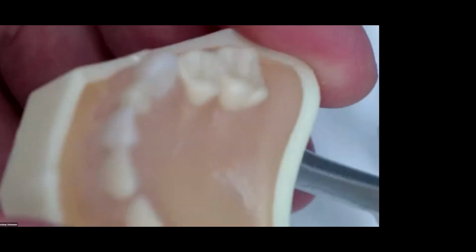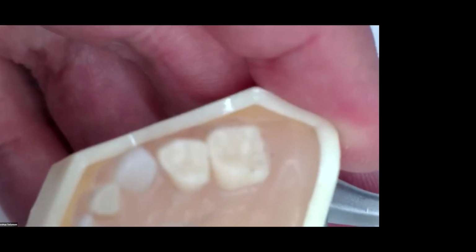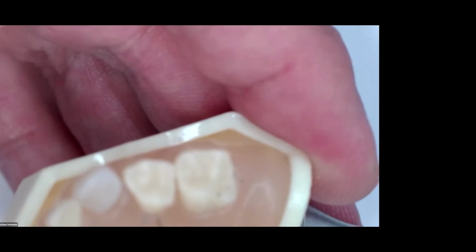Here, let's say I'm working on I and J. So I've come the same angulation, right? So I'm going to turn my patient's head, and it's a little hard to do on camera. And I'm just coming in at that 15 degrees and then rotate in 45.